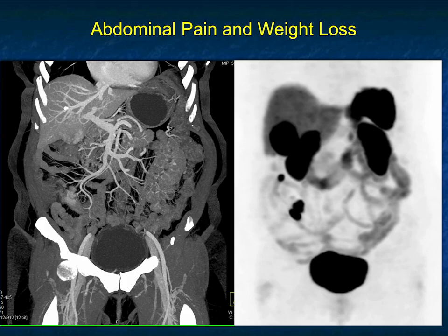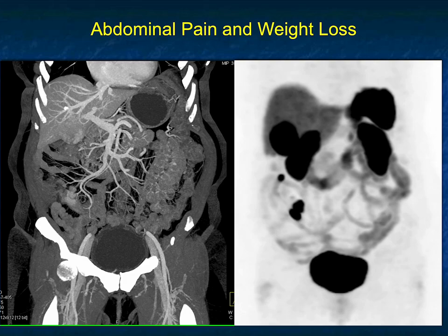In this patient with abdominal pain and weight loss, you see on the CT scan with MIP imaging there's an enhancing structure in the right lower quadrant, which matches the enhancing structure seen on the octreotide scan. There's a subtle mass in the liver, which also matches the study here.